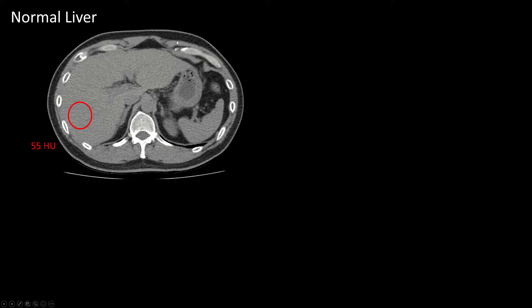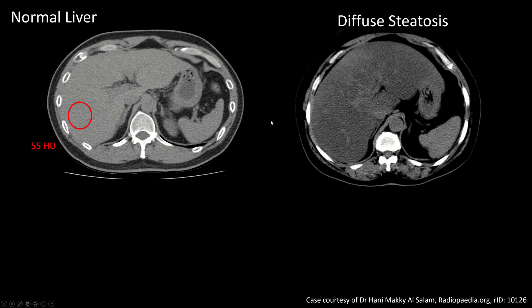Remember that fat has a lower attenuation than water and soft tissue — fat is darker. So diffuse fatty infiltration in the liver is going to reduce the attenuation of background liver, making it look darker. Here is a very fatty liver on non-contrast acquisition with a much lower attenuation — about 25 Hounsfield units in this case.